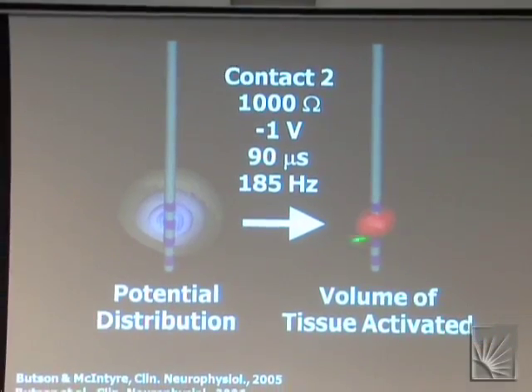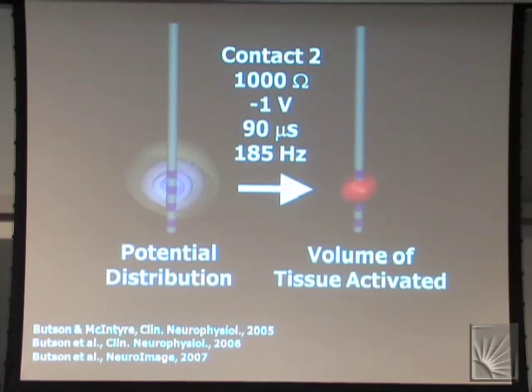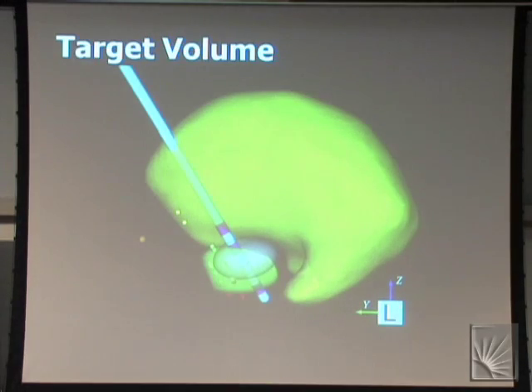And so what we're looking at in this red blob is basically everything inside that red blob, or every myelinated axon inside that red blob, would be suprathreshold for the generation of action potential. And any axons or neural elements on the outside of that blob would be subthreshold for action potential generation. And so that provides now a tool for us to combine with that patient's computer model that we developed in the operating room.